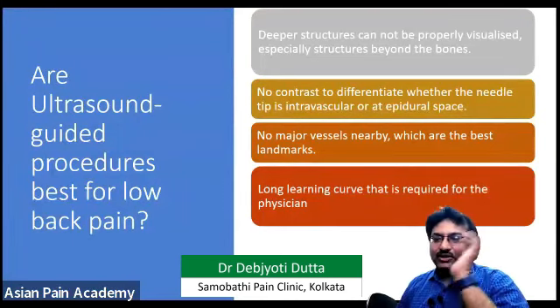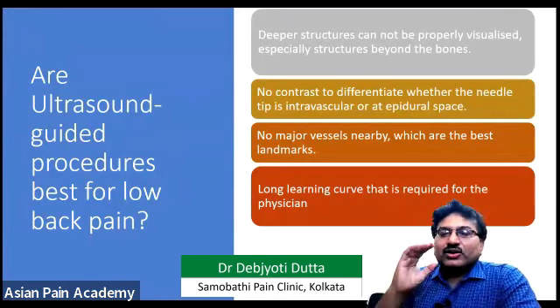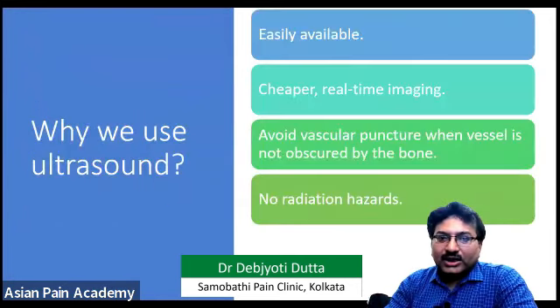Ultrasound definitely has a long learning curve. It requires a long learning curve from the physician to see the structures, to put the needle, everything has a long learning curve.